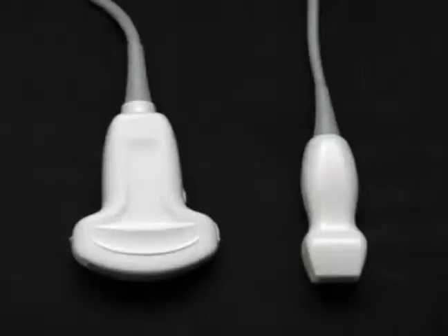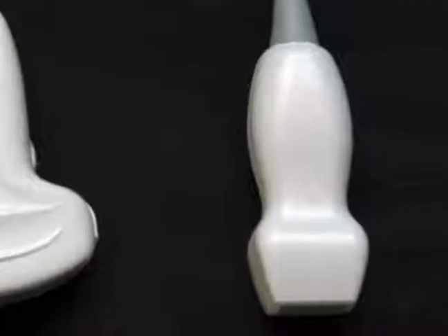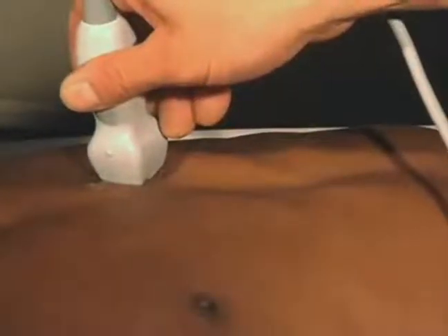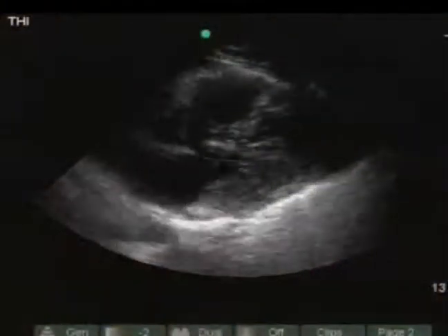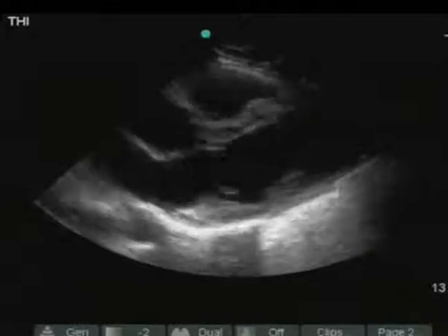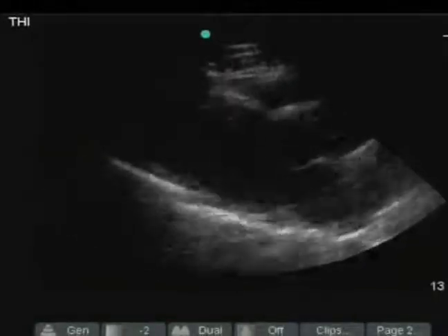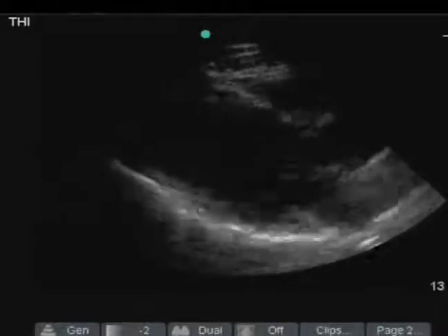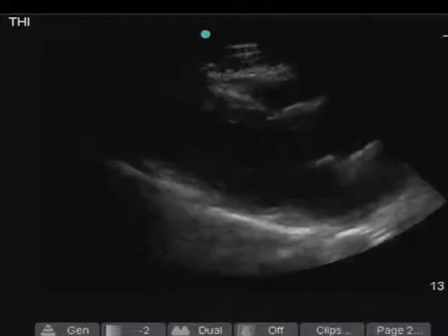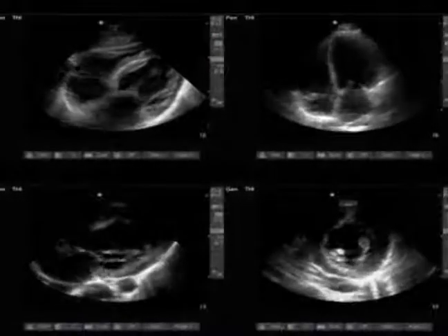The limited ED echo is best performed with a convex, microconvex, or phased array probe. Some emergency medicine texts recommend pointing the directional indicator to the patient's right side during the cardiac exam. This maintains the same visual and anatomic orientation found in general diagnostic ultrasonography. In order to obtain the traditional echocardiographic views, the probe should be rotated 180 degrees with the directional indicator pointing to the patient's left side. The 4 basic views can be performed in any order.